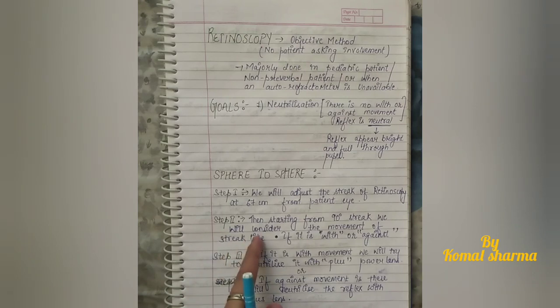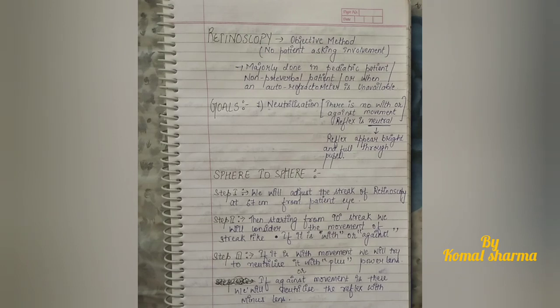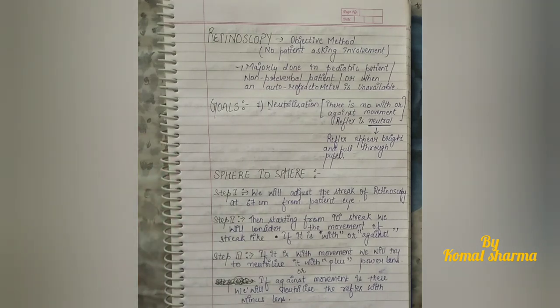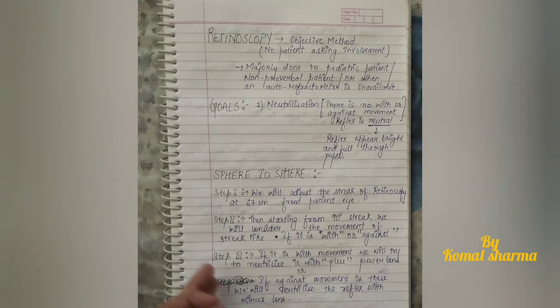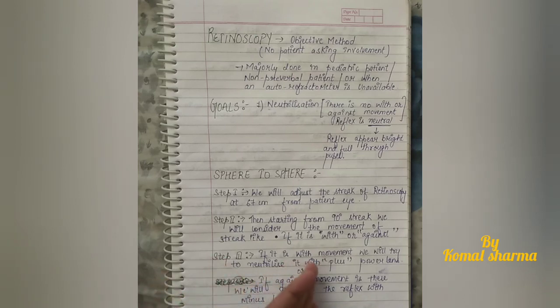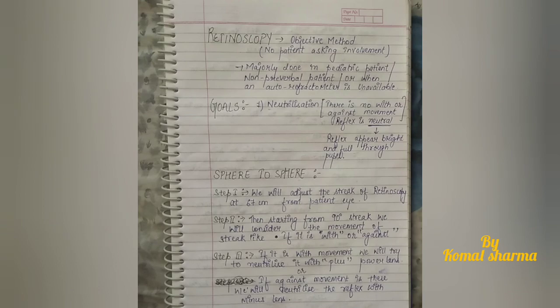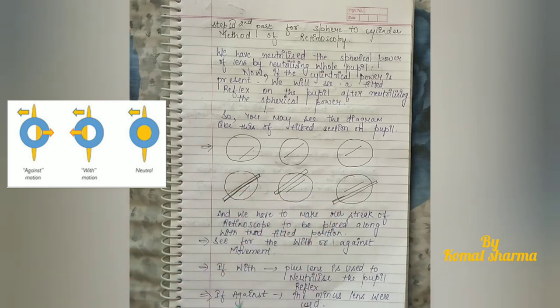In step one, we adjust the streak of the retinoscope at 67 centimeters from the patient's eye. In step two, starting from a 90-degree streak, we observe the movement — whether it is 'with' or 'against.' In sphere-to-cylinder, we consider whatever axis we want to neutralize, since we are neutralizing the spherical power as whole pupil reflex. In step three, if the movement is 'with,' we neutralize it with a plus power lens; if it is 'against,' we neutralize it with a minus lens.